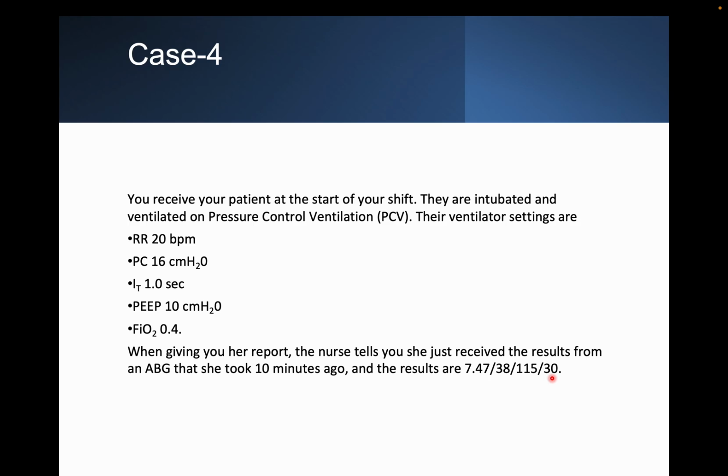So there is alkalosis definitely, so you need to retain more CO2. In this patient, you decrease the respiratory rate. To decrease the tidal volume, you decrease the pressure support. Whatever pressure control is there, you need to decrease the pressure control also in this patient. So you decrease the respiratory rate to preserve more CO2, and also to correct the alkalosis.